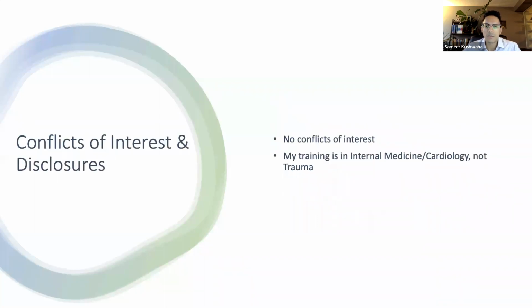I don't have any conflicts of interest, but I should mention that my training is primarily in internal medicine and cardiology, not in trauma, so I speak mostly from that particular lens of this topic. If there's anybody in the audience who has more experience in trauma medicine, I'd love to hear your perspectives later on as well.